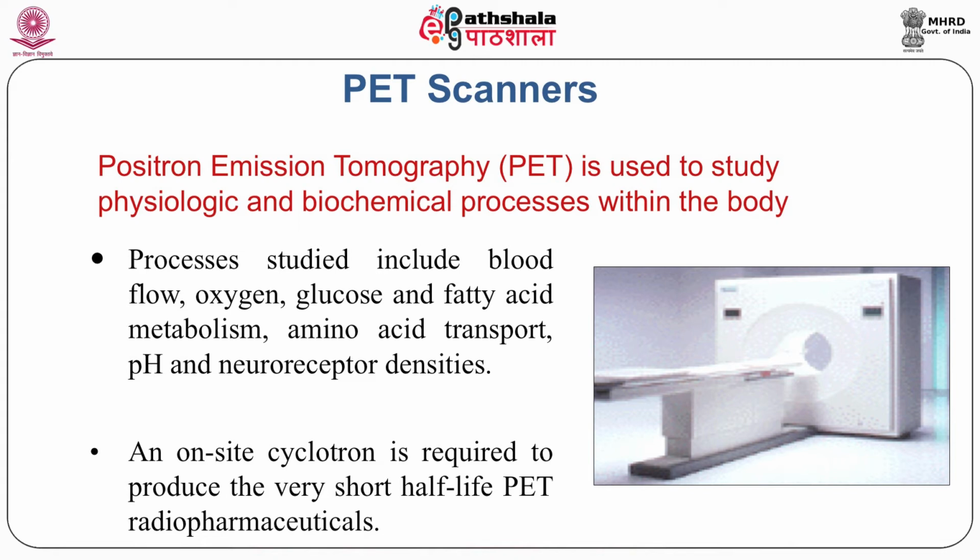And because these radionuclides used in PET scanners are produced from a cyclotron, we definitely need to have a cyclotron at our place, because of the short half-lives. But more than 90% of examinations you can do with fluorine-18. Some clinical examinations which are very typical in nature may require other kinds of radionuclides which are produced from a cyclotron and have short half-lives.